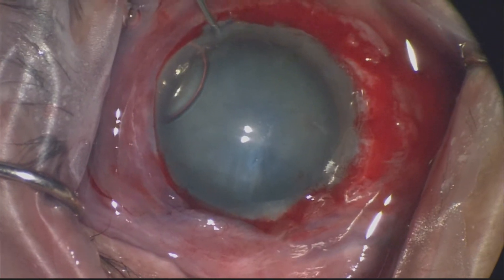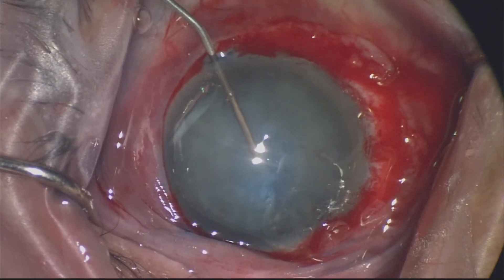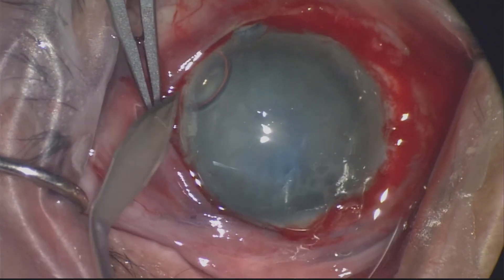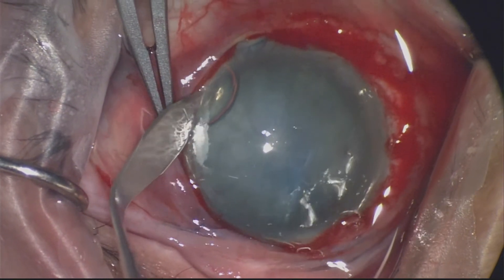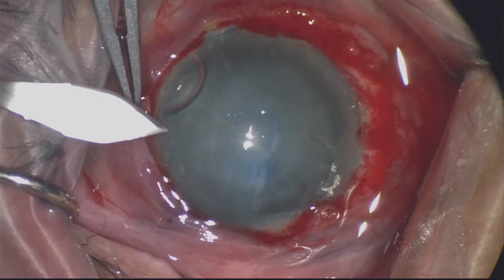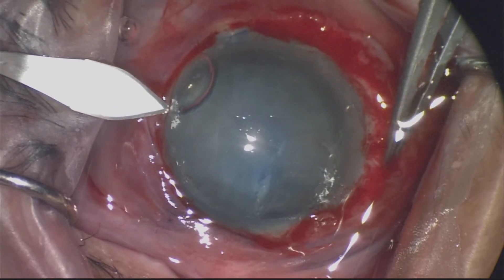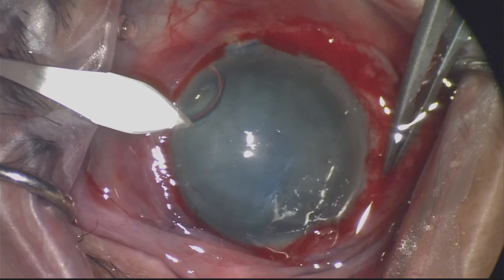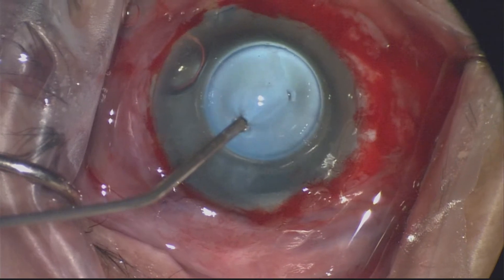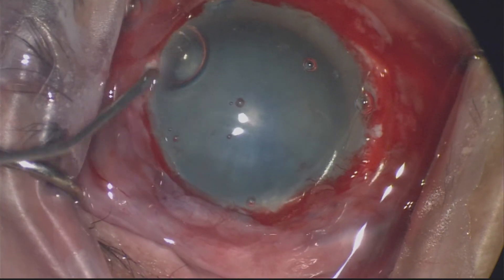Now I'm using a soft shell technique, going in with my cohesive viscoelastic just above the anterior capsule. I'm doing a three-step incision, going relatively close to the limbus — I don't want to go too far into the cornea. I'm not going fully in because this is a white cataract — unpredictable. You want to go just far enough to get a cistotome in or a pair of long forceps.